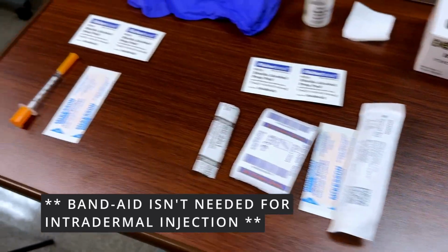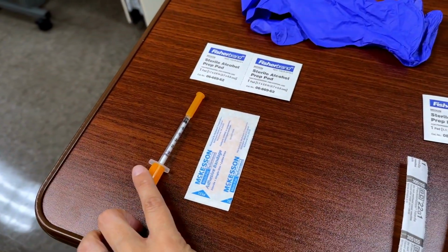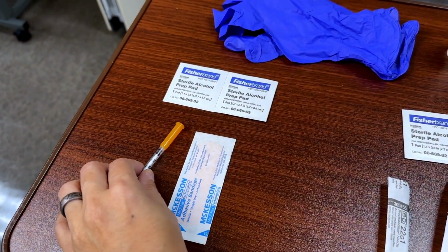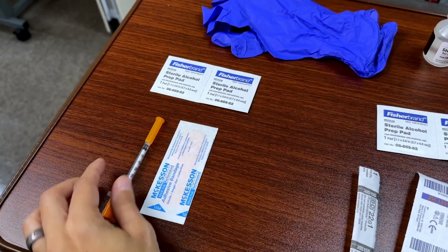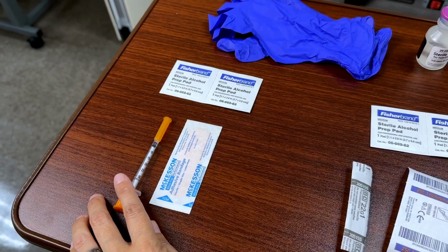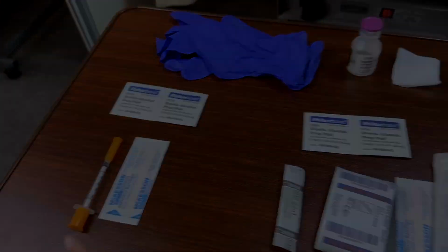What I didn't notice, and what I should have mentioned, was for the insulin syringe, the needle is actually attached to the syringe itself. And so for these, you're going to use the same drawing needle as you will inject.